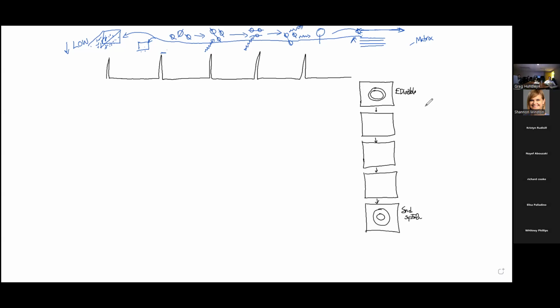So at the top now, you see a QRS complex. All right. And the way this is going to work is we're going to need to make these movie frames.